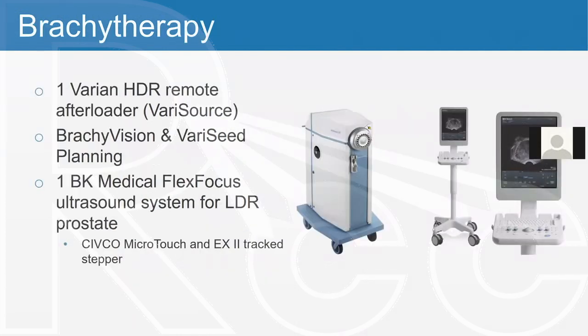So for brachytherapy, we have 1 Varian HDR remote afterloader. It's a Verisource. We also do Veriseed for our LDR planning. So we do prostate seed implants. And we have a BK Medical Flex Focus ultrasound system. And I'll talk a little bit about that in the talk as well, because we do use that for HDR planning.